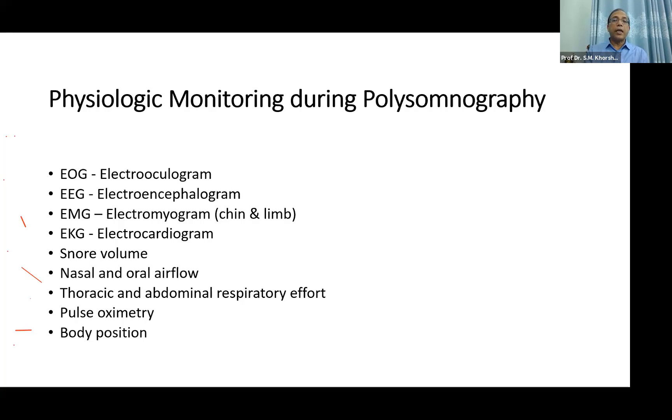I'll show you a video of how polysomnography is done. We, the ENT specialists, sometimes send people for doing a polysomnography. This is a very short video of two minutes showing how a polysomnography is done in a lab.